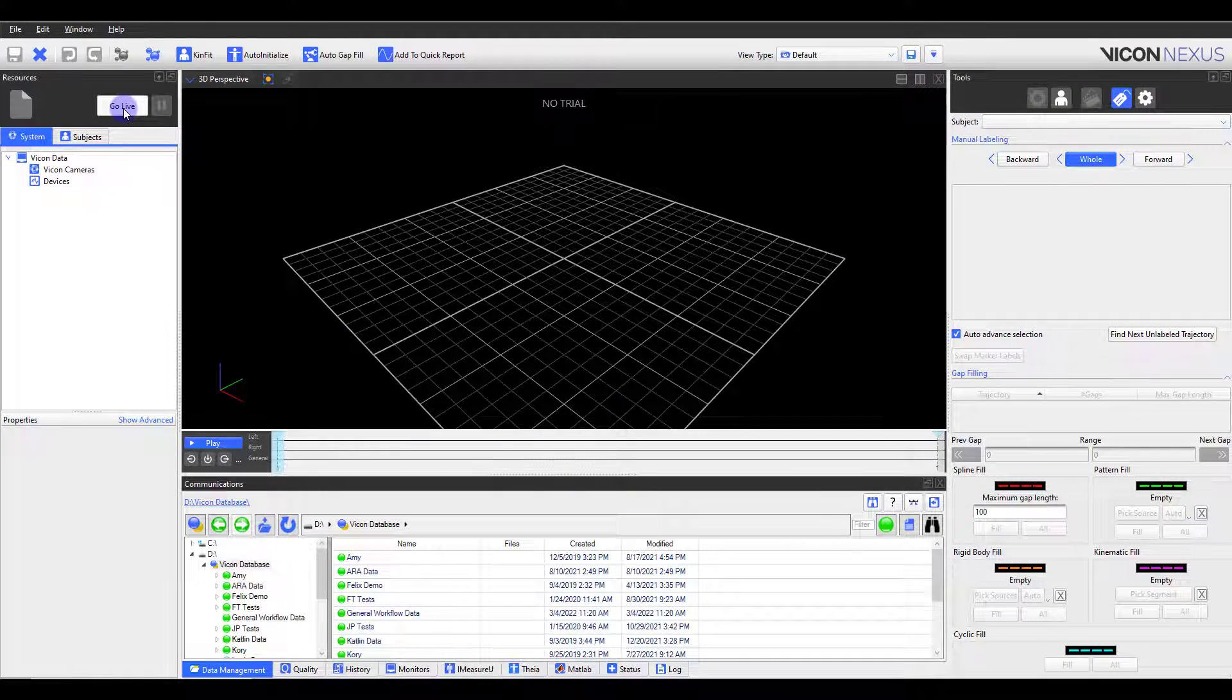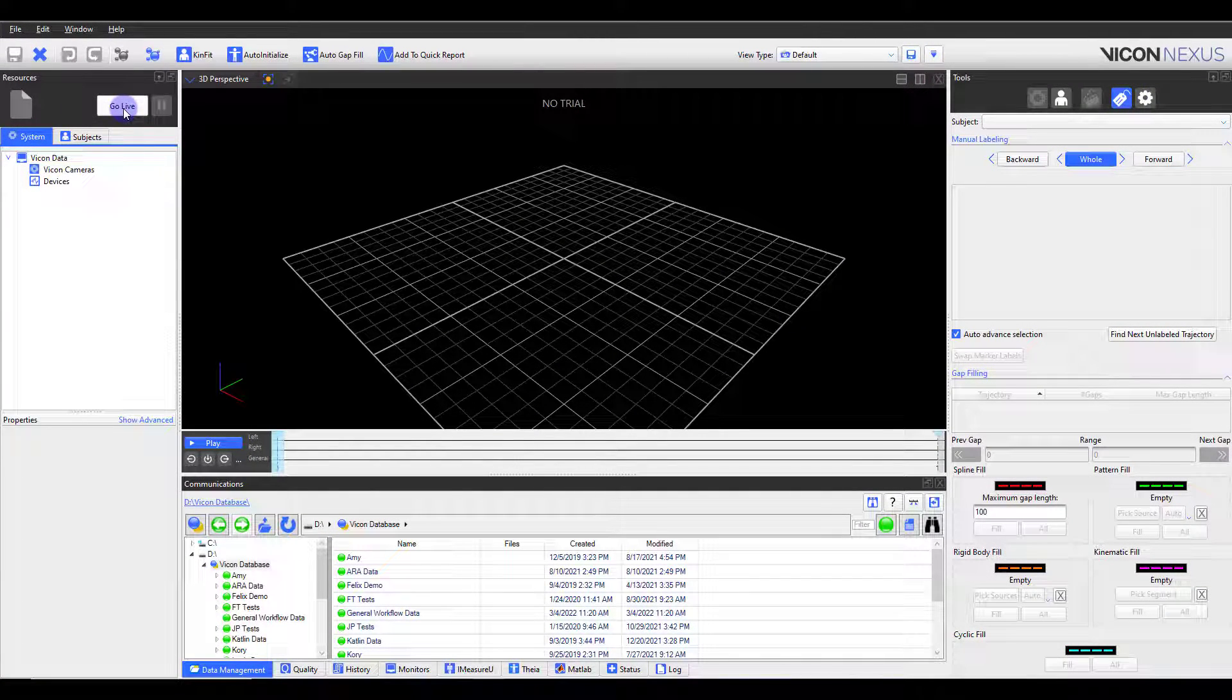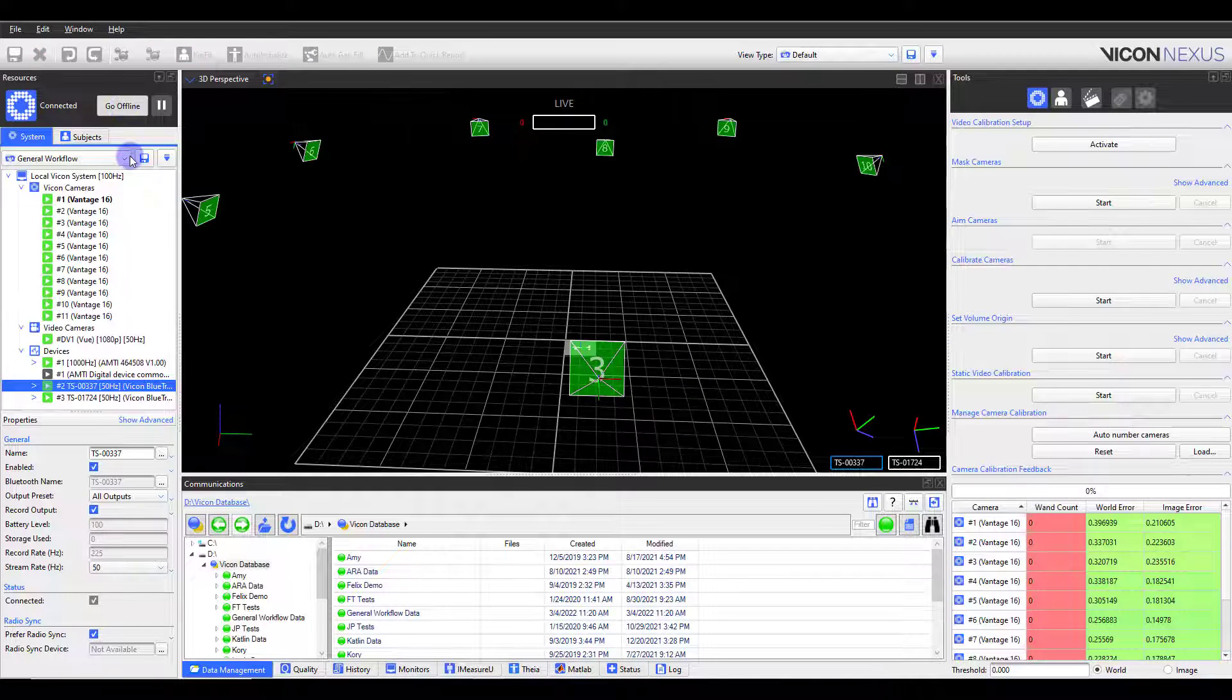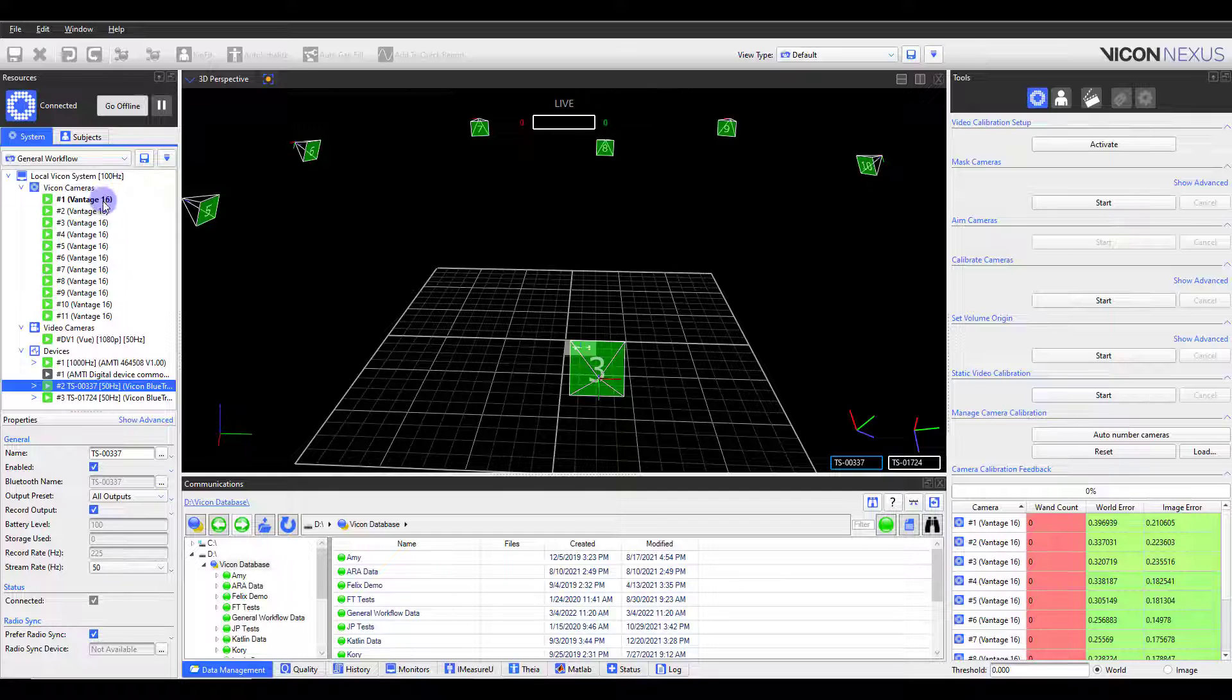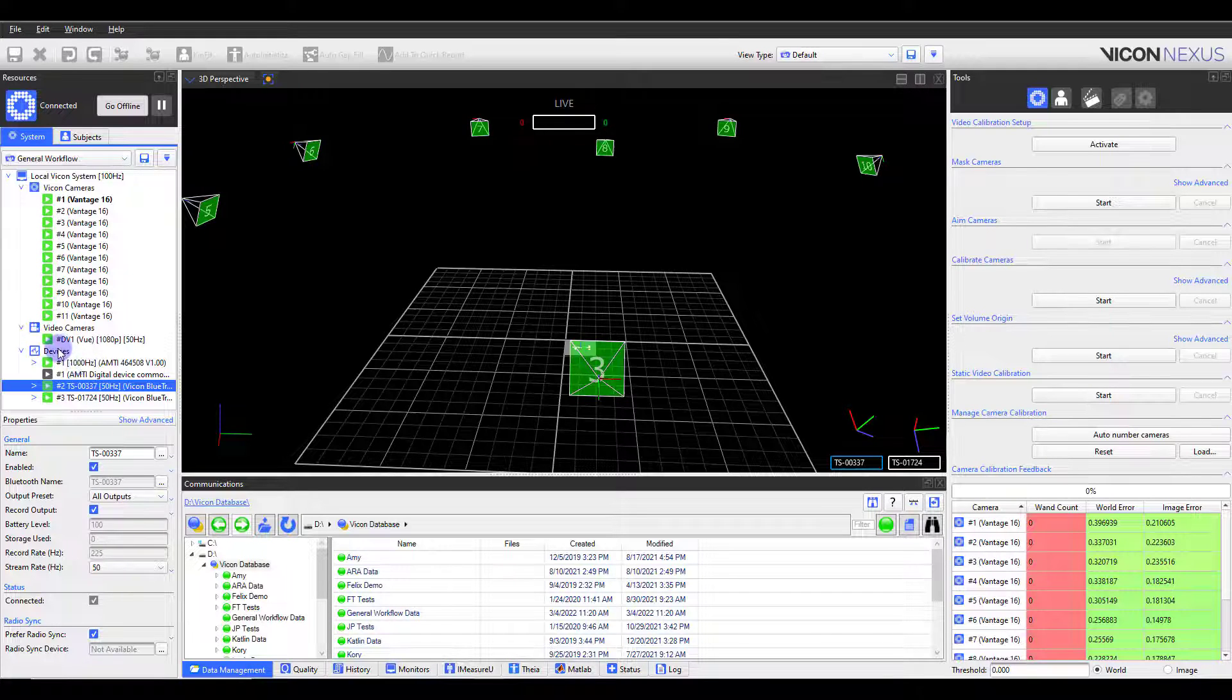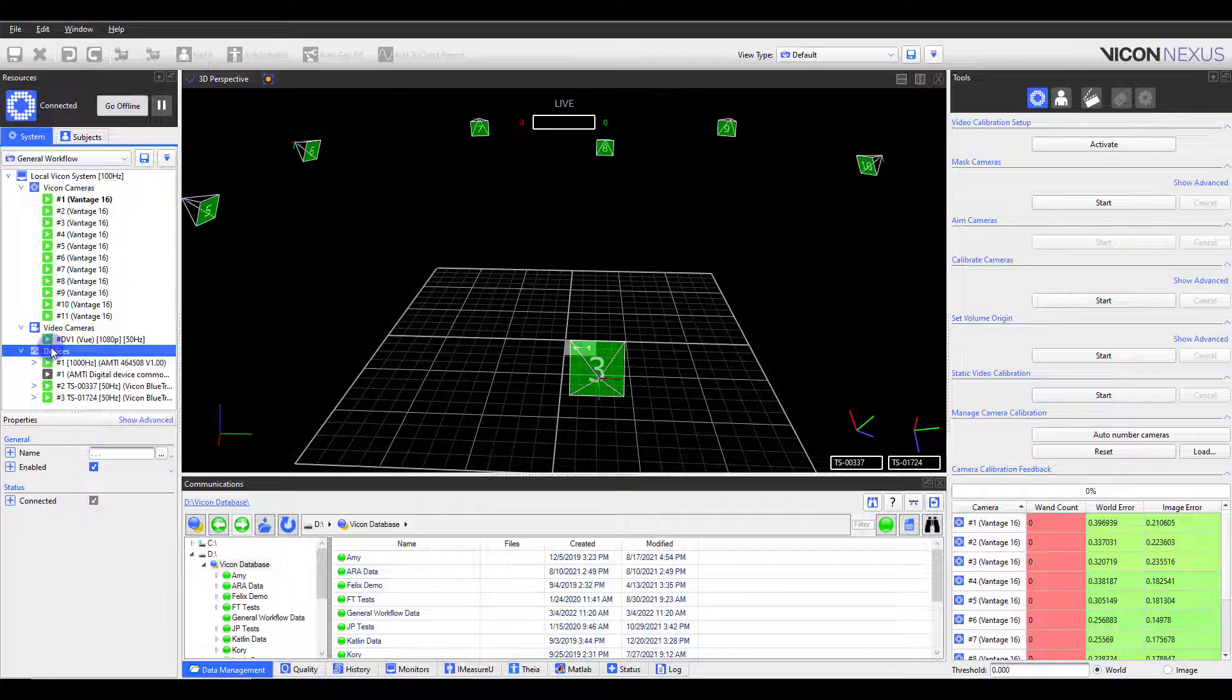Before starting Nexus, confirm your Vicon system and any third-party devices are powered on and connected. If you are not already live when you open Nexus, click the Go Live button. Next, select the appropriate system configuration from the drop-down list. You should see all cameras connect with the green play button. Any third-party devices will appear under the Devices section. You can add any other devices by right-clicking on Devices and adding the appropriate device.